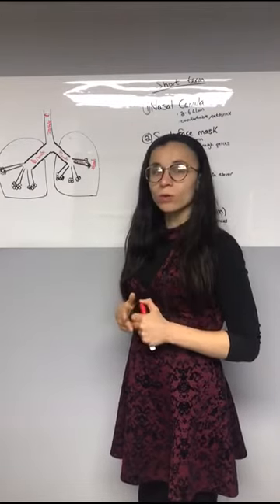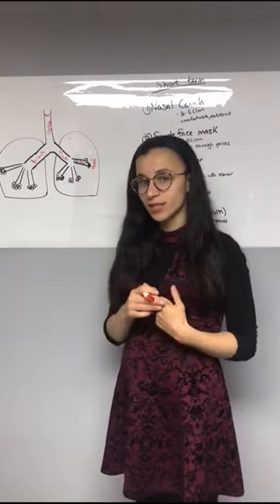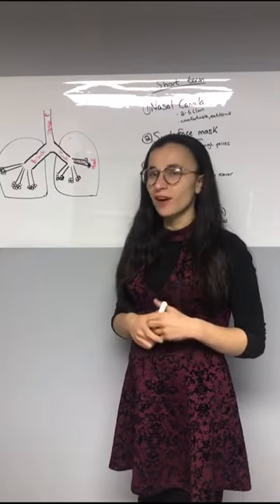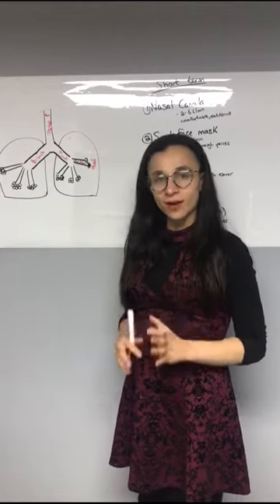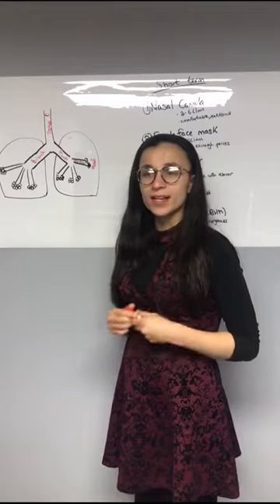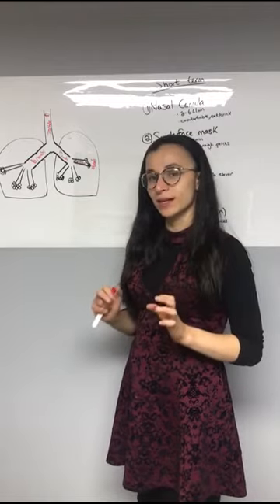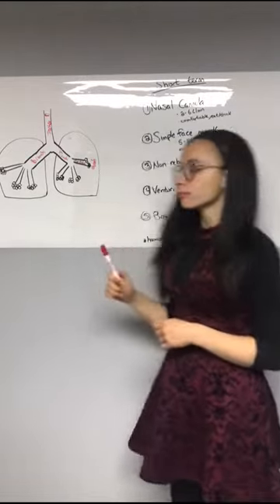For a normal person, you want their oxygen saturation, when you do the pulse ox, to be at 97% to 100. If someone's 95 to 100, you wouldn't really worry about that. But if they're below 95%, you want to get them on supplemental oxygen. What that is, is that you're giving them a little bit more oxygen so they could maintain the 95 to 100% you want them to be at. So here we're going to go through the devices that we need.